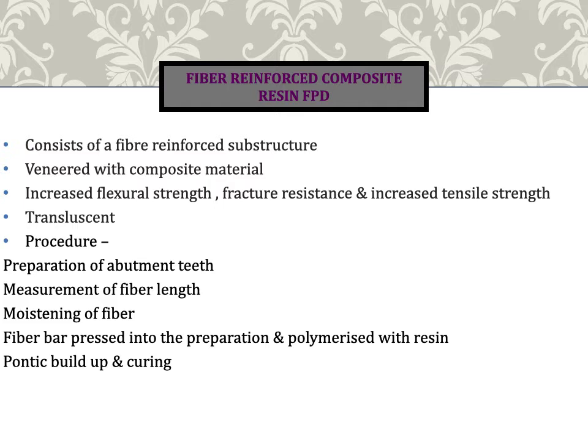Now we'll be discussing fiber reinforced composite resin fixed partial dentures, which are also a type of resin bonded bridge. This consists of a fiber reinforced substructure. It is veneered with composite material.